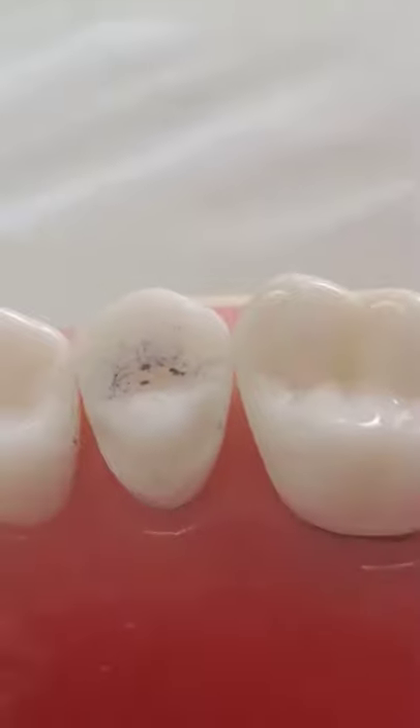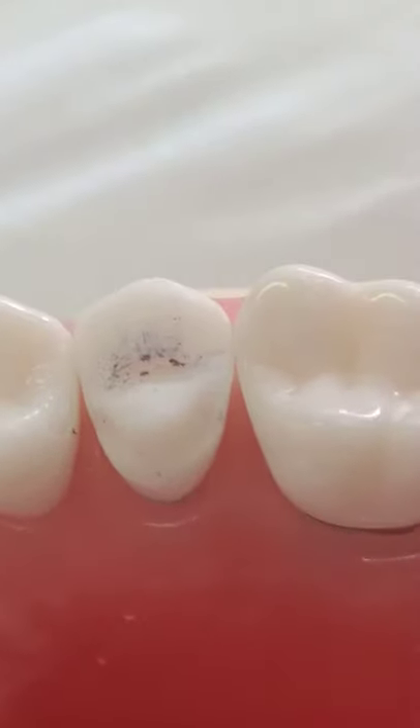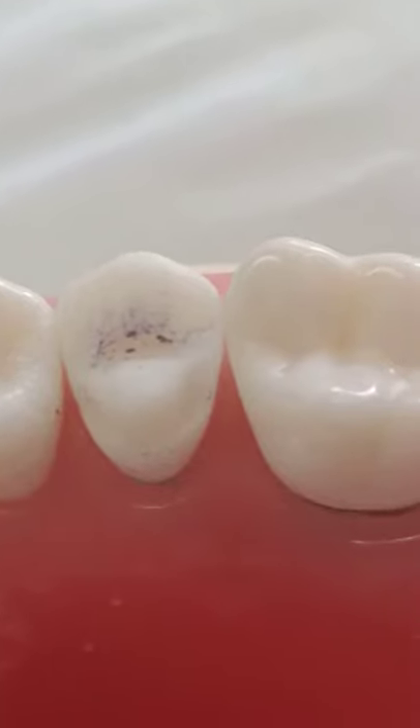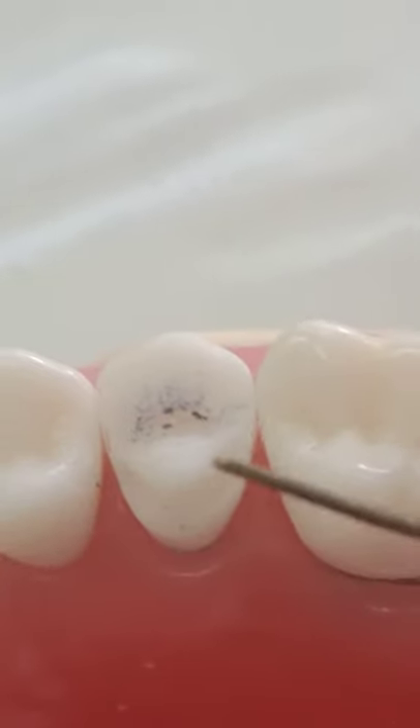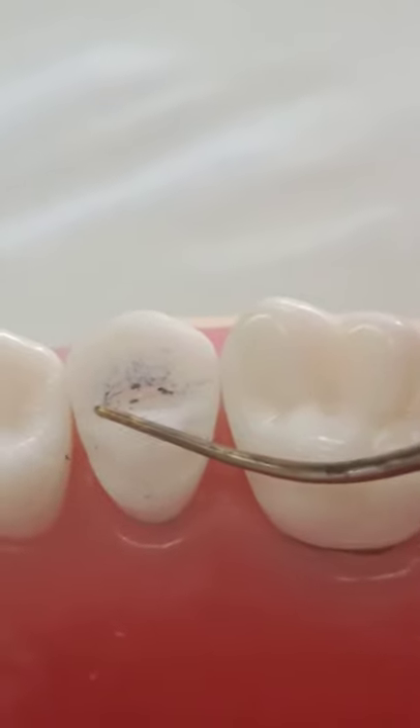You had sharp angles at this internal angle, a sharp angle here, and a sharp angle here. If I leave sharp angles, I will have a problem of stress concentration under ceramic restorations.